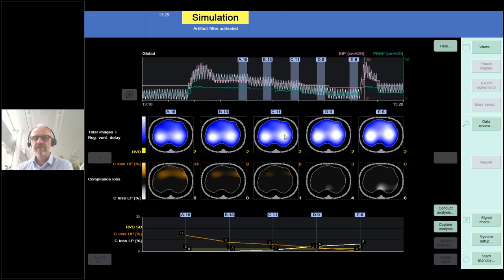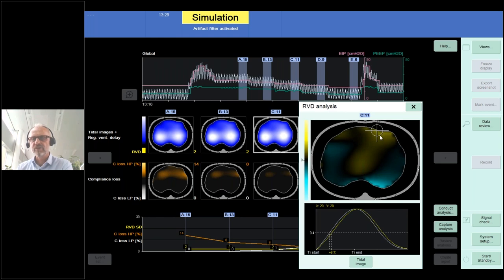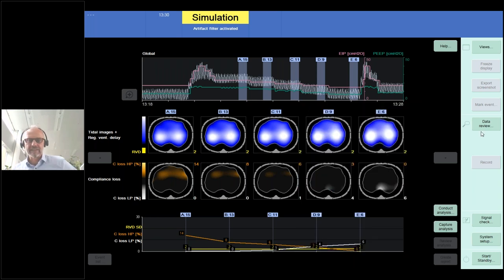Also remarkably, there's no large presence of regional ventilation delay. So no matter where you look in your lung region, any pixel is following more or less the average course. And that is a typical pattern that you would also see in spontaneously breathing volunteers or people with healthy lungs, except they have a very strong respiratory force. Then typically the air in those subjects would go quicker into the dorsal part of the lung due to the diaphragmatic movement. But in those patients, you can already be very sure that this patient doesn't have any issues with time constants or cyclic opening and closing.